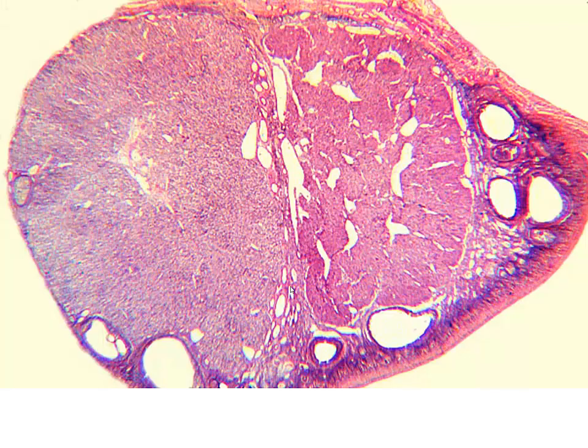Here we can see a section through the ovary, and we have two very large corpus lutea. These are in different stages of development. Here we can see the folded nature of this corpus luteum, but you can see how large this corpus luteum is, how it's filled with these granulosal cells that are just chugging out the progesterone to maintain the endometrial lining for about those 2 weeks period of time before menses would occur.